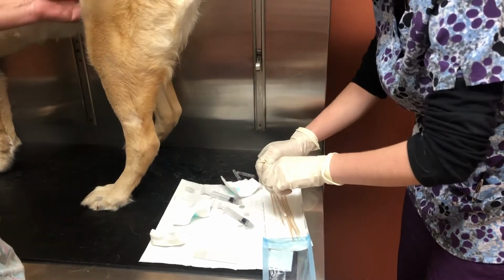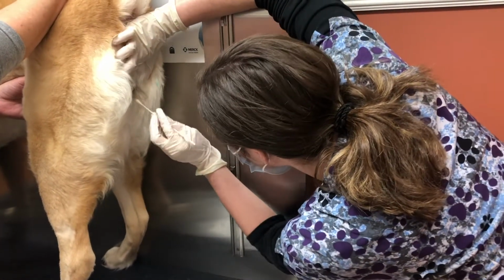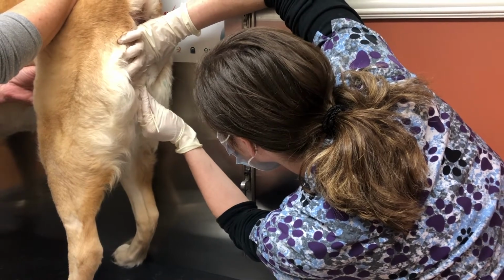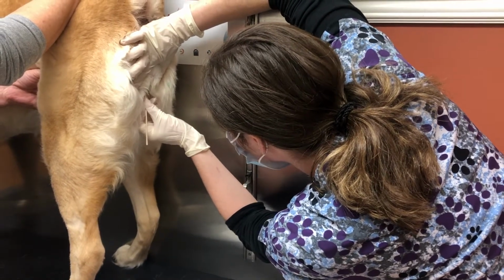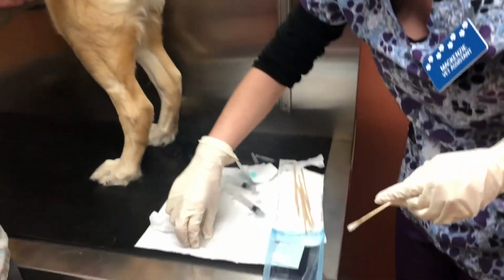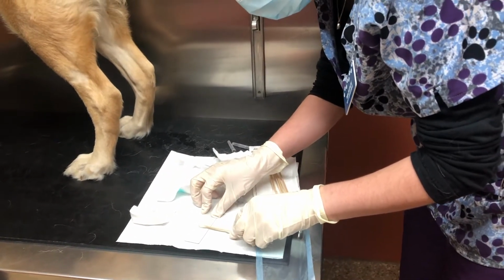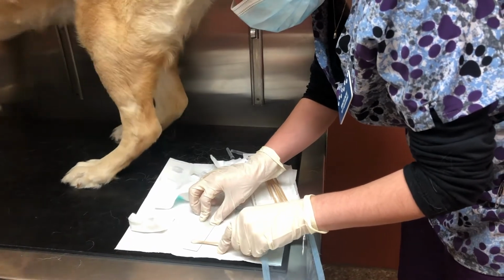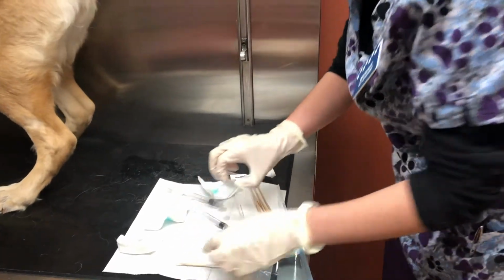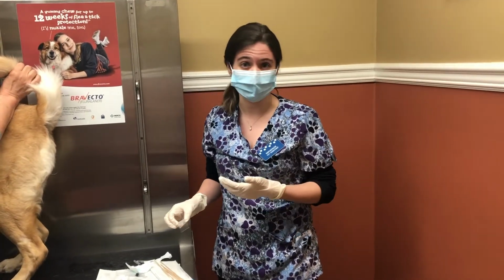And I'm going to insert my swab at a 45-degree angle into the vulva so that I can advance it into the vagina. And I want to rotate it around a little bit so that I can get some of the cells on the vaginal wall. And I'm going to take my microscope slide, and I'm going to gently roll my swab onto it. And I'm going to take my slide to the microscope so I can take a look at it and see if I can identify the stage of estrus that this patient is currently in.